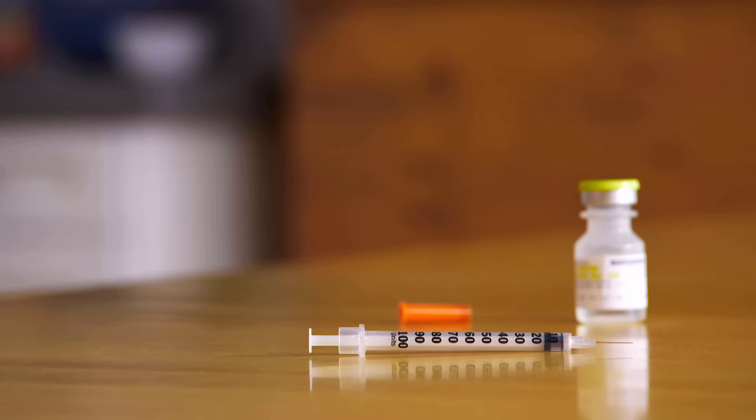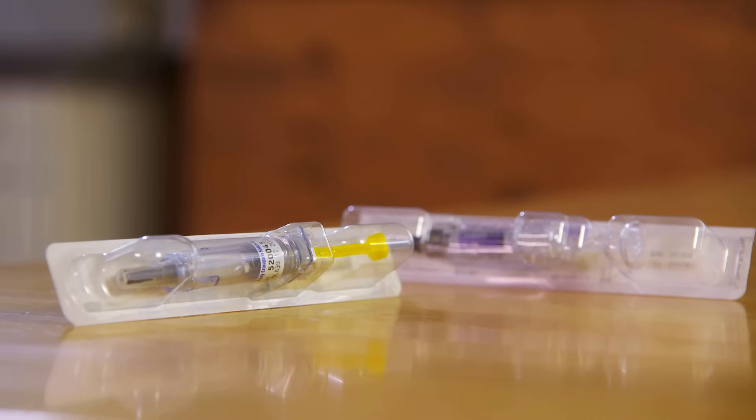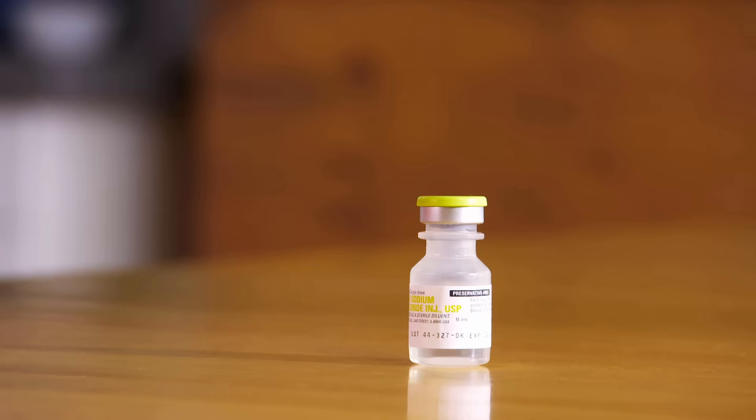The medicines used for subcutaneous injection are packaged in several different ways. Some medicines come in auto-injectors or pens, like this one. Auto-injectors already have the medicine loaded inside them. Others come in traditional syringes pre-filled with medicine. And still others come in vials — you withdraw the medicine you need from the vial each time you give yourself an injection.